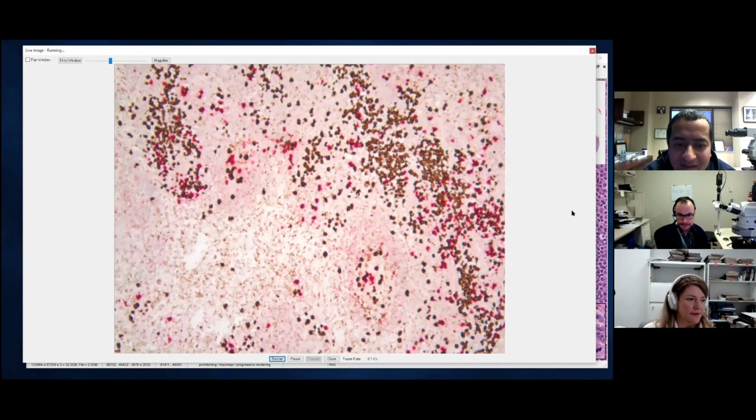But okay, so this area here is kind of interesting. Here we can see is probably a residual germinal center. And then we've got plasma cells outside that are polytypic, maybe a little kappa predominant, and things going on in this germinal center, kind of mixed. And here it's a little bit challenging, but I think you can see that there is some lambda for sure, that's pink, and then some kappa. But then we have these areas potentially in a marginal zone like distribution, or kind of expanded here, that are our B cells that are more brown, that are more kappa restricted.